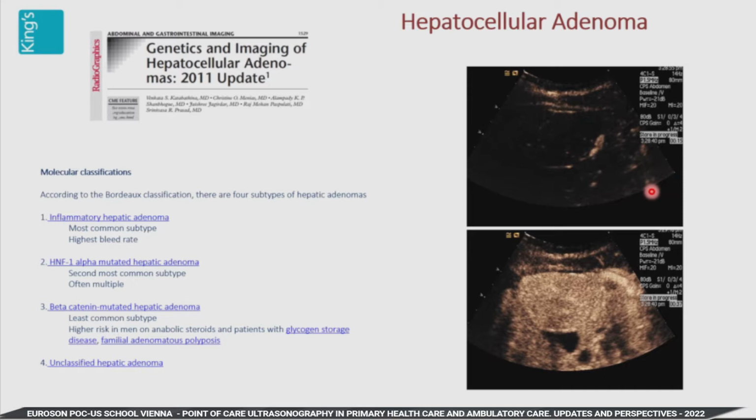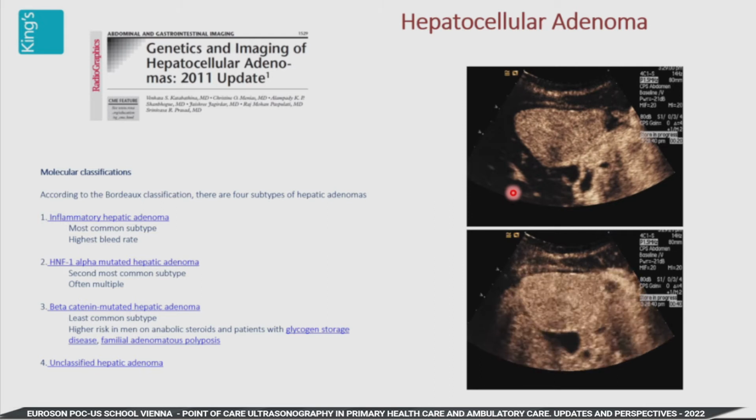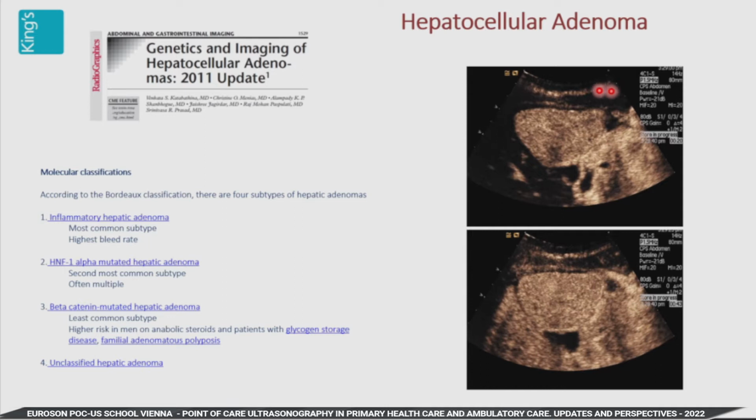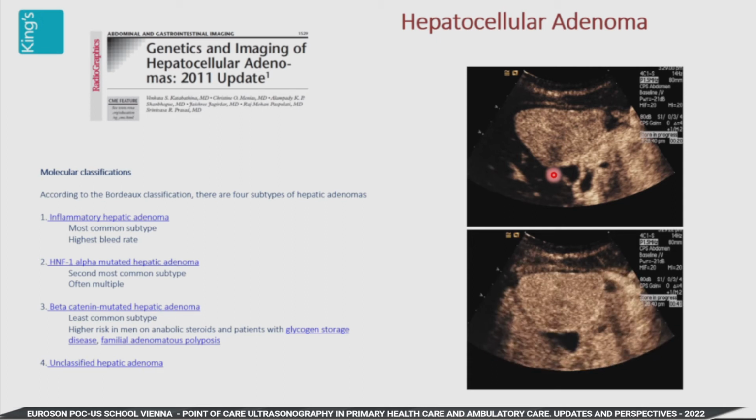you may have different histology, and 1 or 2 of the more malignant potential histology actually washes out. But it has a different pattern of enhancement where it comes in from the periphery, but it remains hyper-enhancing. It doesn't wash out in the late phase. So if you're starting to see washout after 1, 2, or 3 minutes, you're dealing with something that's malignant here.